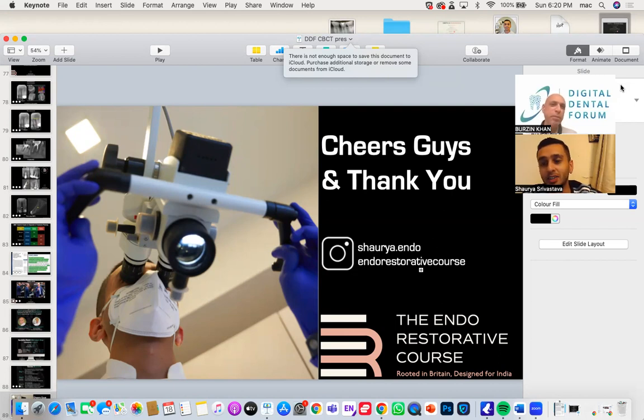Would your treatment plan differ if you diagnose a cystic lesion, and how would you treat it? No, I mean, I can't conclude that based on radiology. So if it's a suboptimal root filling or a root filling done without a rubber dam, not up to standards, and there's a corticated margin, I will still do the endo, monitor the tooth for about 6 months to a year.